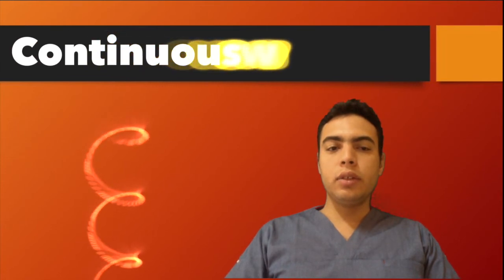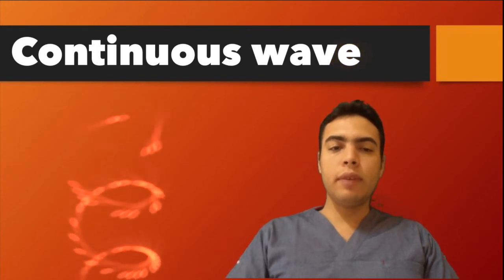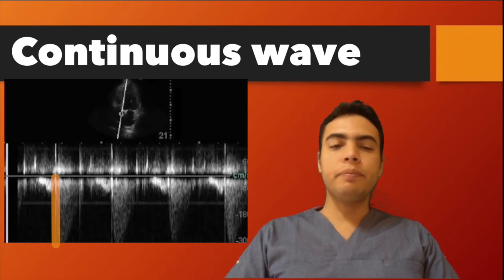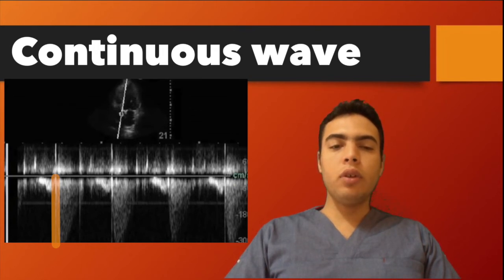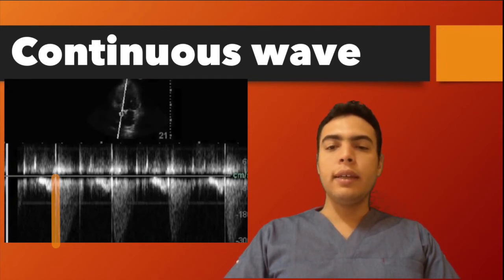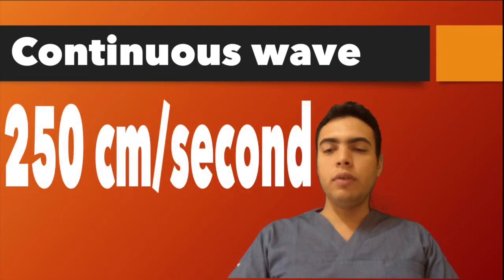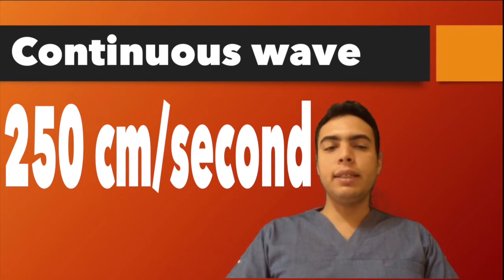To detect stenosis, continuous wave Doppler is used. When thrown along a straight line it records peak velocities in that area. Applied to the aortic valve, if there is aortic stenosis the peak velocity will exceed 250 cm/s — the normal peak — indicating the presence of stenosis.